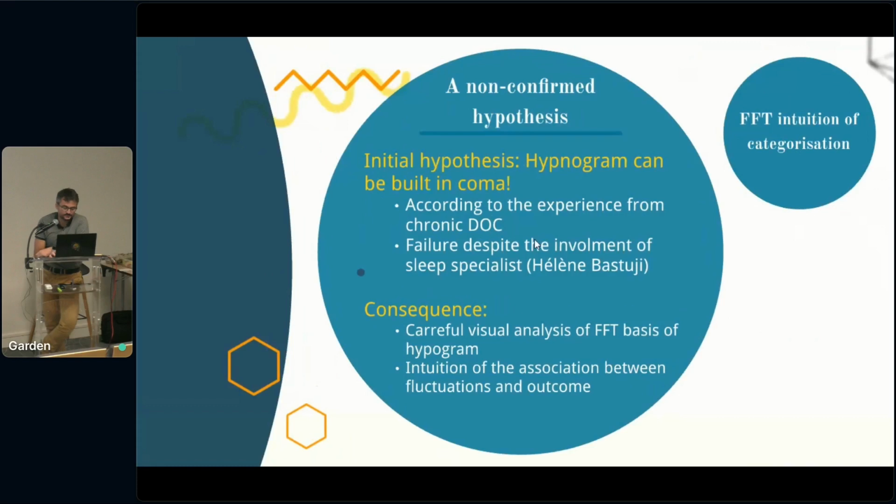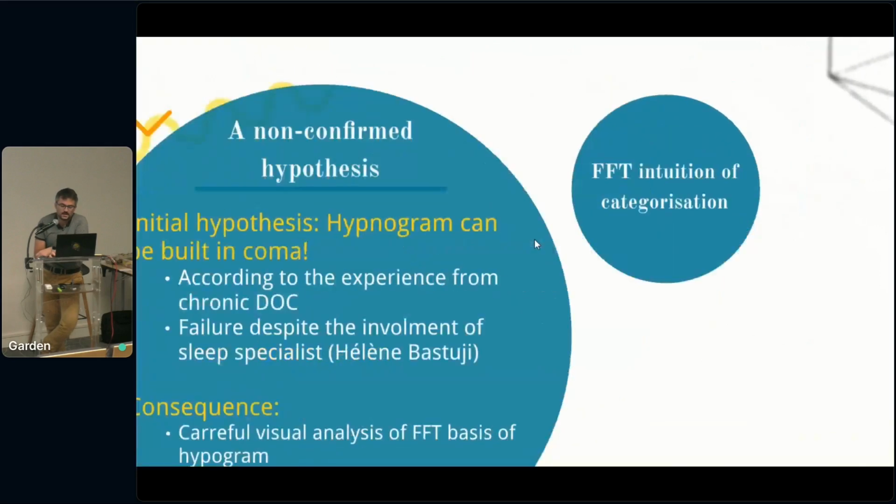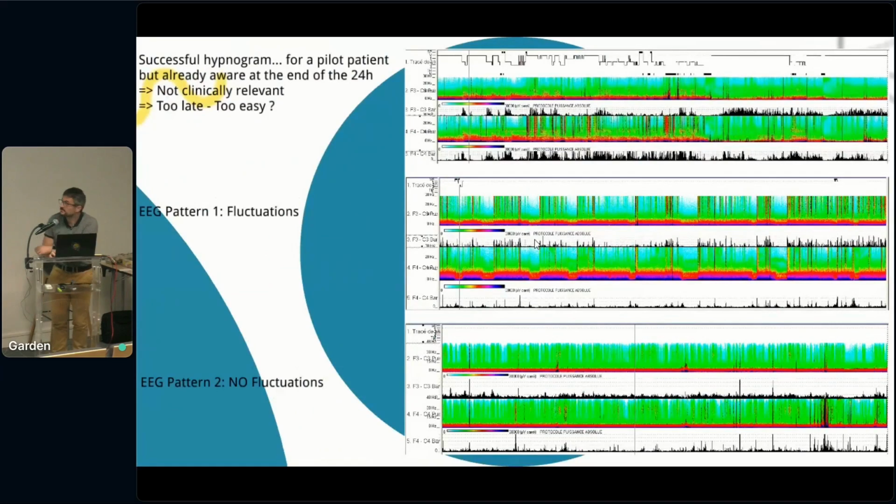perform. And then we had the intuition that there is an association not with the sleep patterns, but with the fluctuations of FFT and the outcome. For example, we had this very seminal patient, the pilot patient that we were not able to keep in the last analysis because, in fact, it was too easy. It was already almost aware because at the end of the recording, it was able to respond to simple command. And it was possible to build a hypnogram for him.